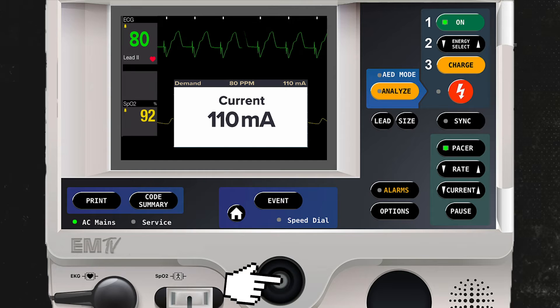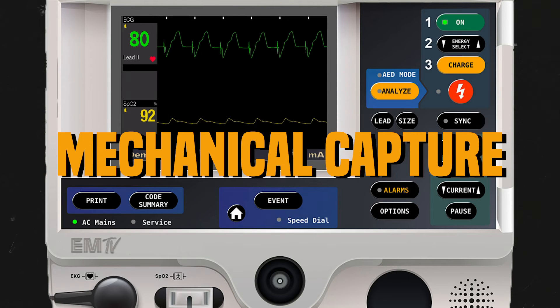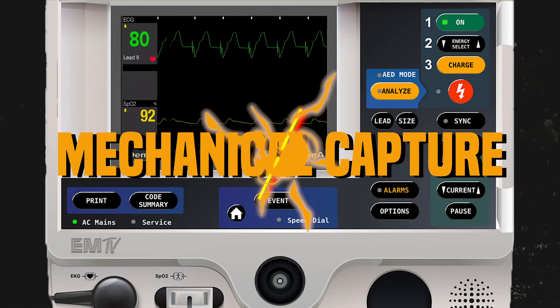I'll then press the jog wheel to exit this screen. At this point, I will confirm the presence of a pulse that matches my paced rate. If the pulse matches the rate that I've set the pacer, mechanical capture has been achieved.